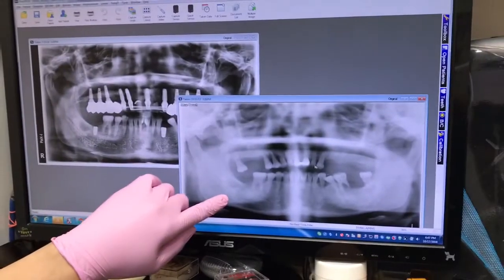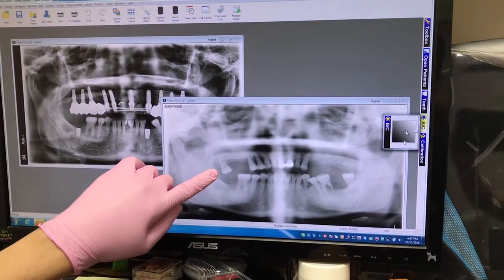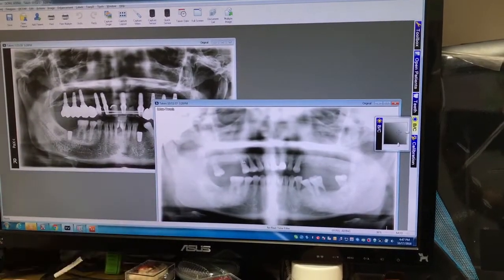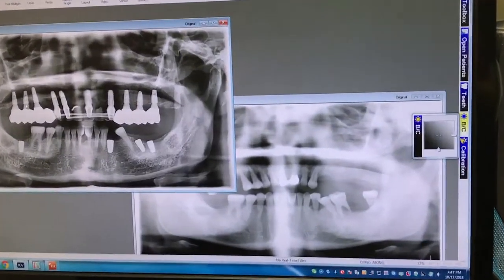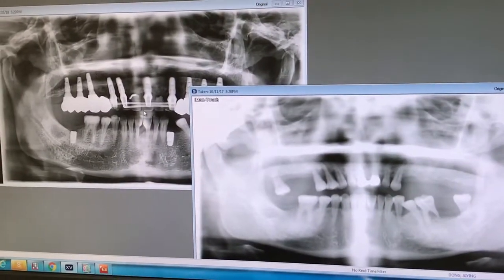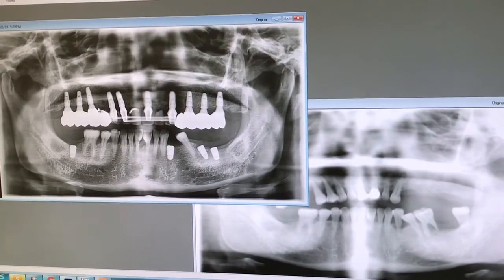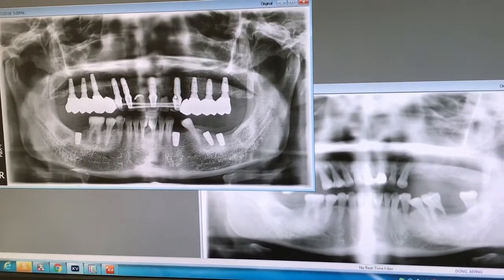Today we're inserting an upper bridge. This patient came in with very severely gum-disease teeth — all these teeth were loose. We did it in sequence for this particular patient because of the quality of the bone. We did the top last time; today we inserted the front.